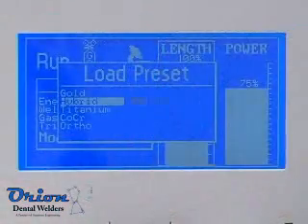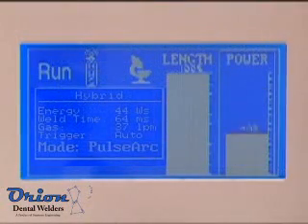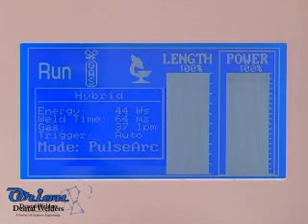Presets are available to get you started in the welding process. Always start with small amounts of energy and work up in power. Sunstone welding technology produces high peak energy to start the welding process and the energy gradually tapers off. Setting the pulse length to 100% will give you the most energy taper and will also result in a smoother weld puddle.